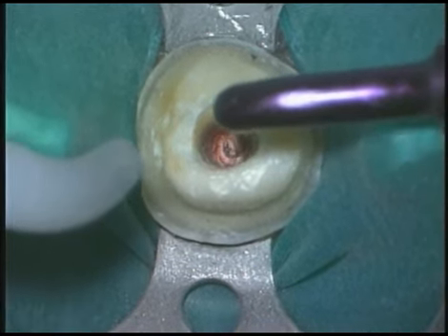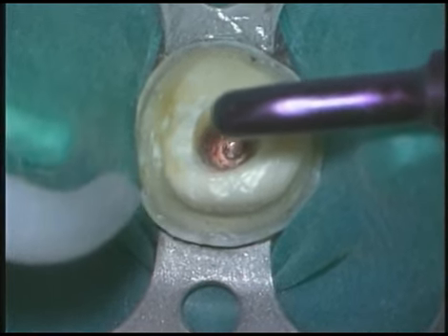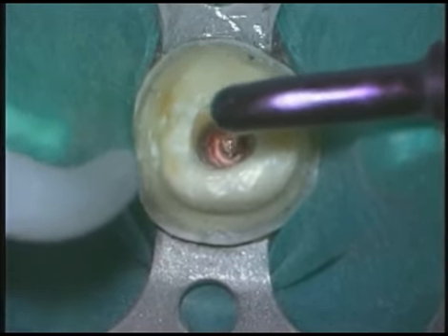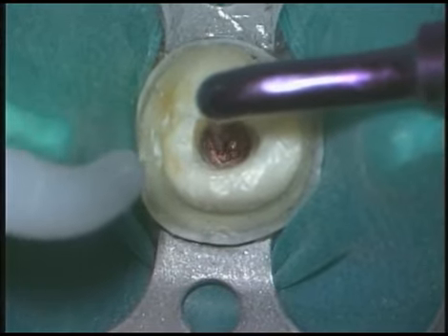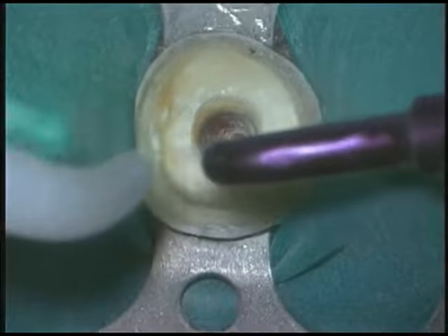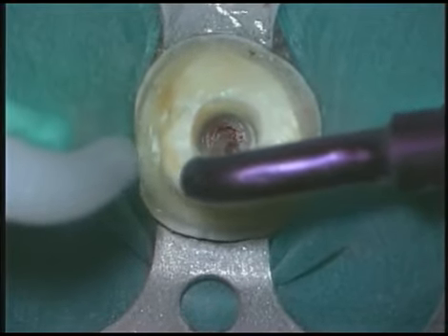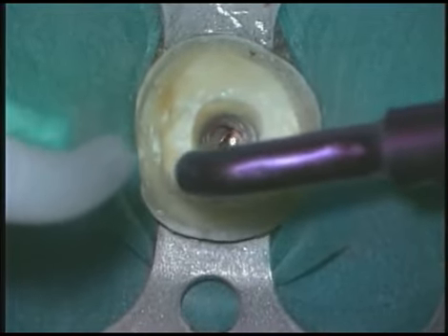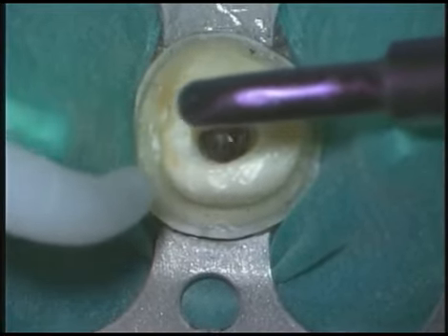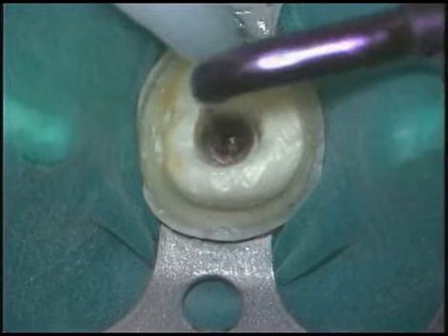Titanium endo-ultrasonic instruments are used because their small profiles work deep in the root canal space. Importantly, their small profile gives us unsurpassed vision. The instrument's smooth cutting action and high tip energy allows us to thermal soften gutta percha. By softening the gutta percha, it allows the tip of the ultrasonic instrument to progressively work circumferentially around the broken obstruction.